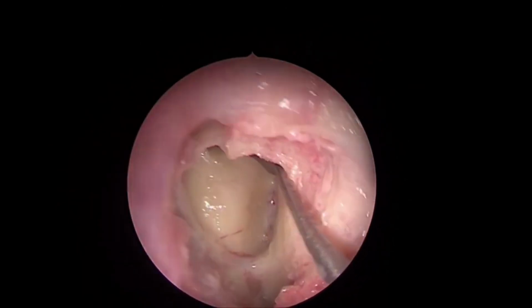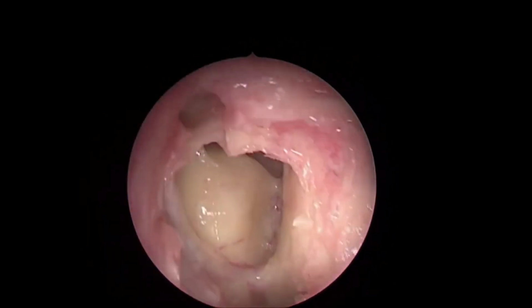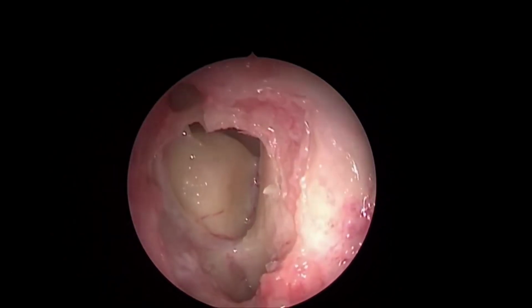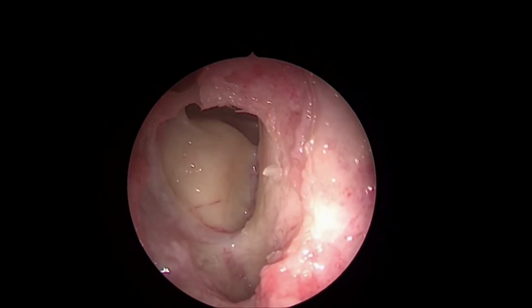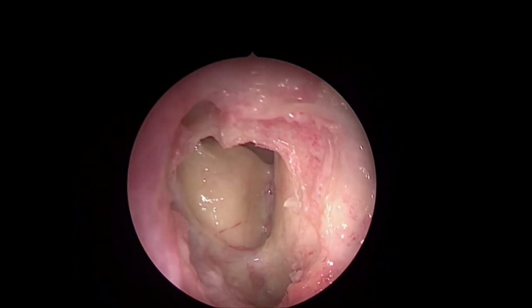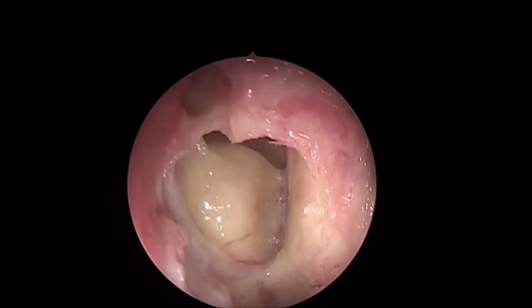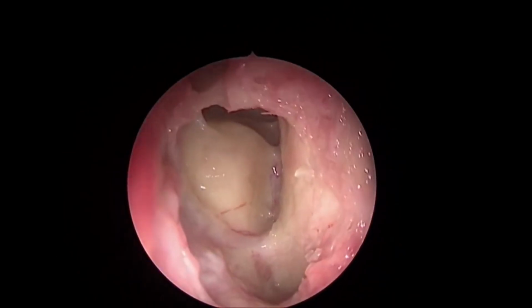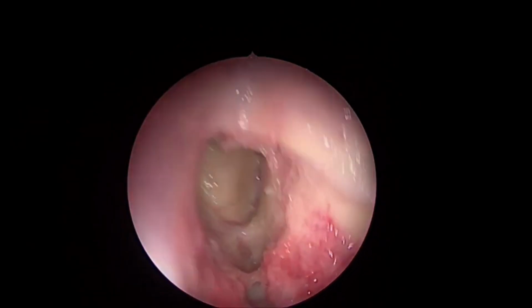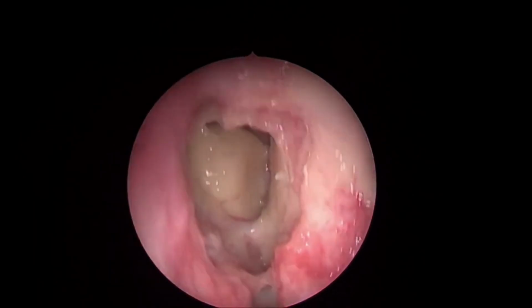In the extended approaches to the sinuses, as I mentioned earlier, the applications have been expanding. Professor Wolfgang Draf revolutionized the concept of frontal sinus surgery again, the endoscopic concepts, by introducing certain approaches known as Draf approaches, expanded approaches to the frontal sinus to address difficult areas and extensive lesions of the frontal sinus. Now the applications have expanded for other regions, not only for sinusitis.